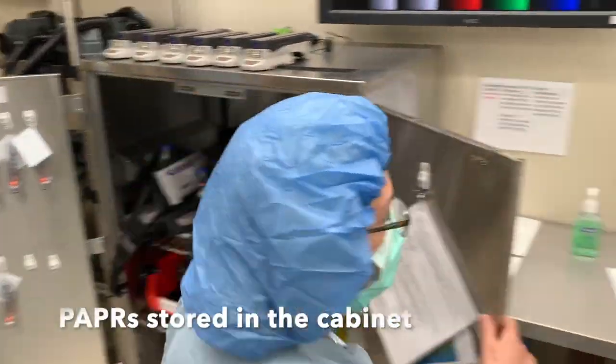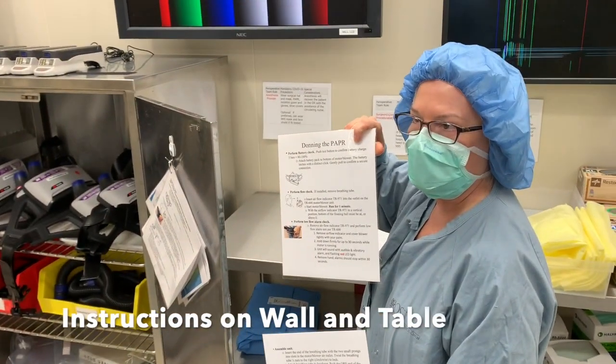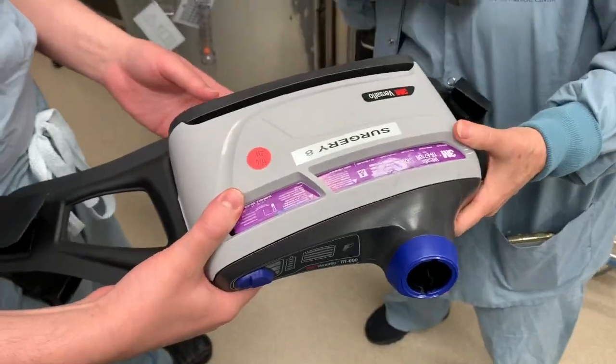We have the PAPRs stored in a cabinet in the ante room, which is a room adjacent to the OR. The instructions are on the wall and in the table. The first thing you would do is check the battery to make sure there are five bars.